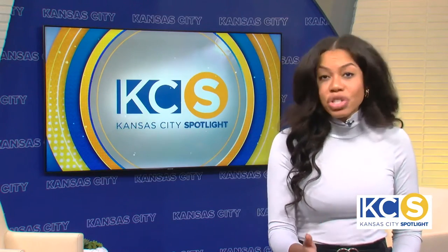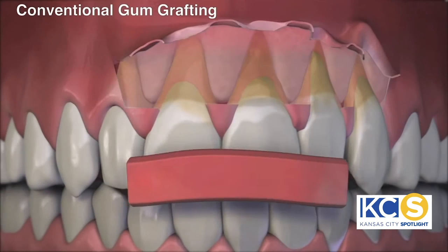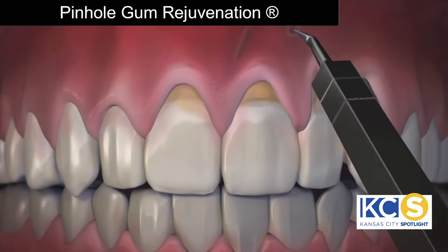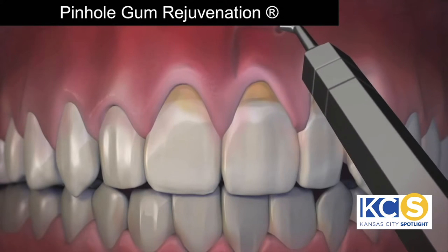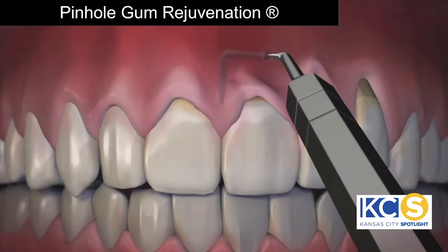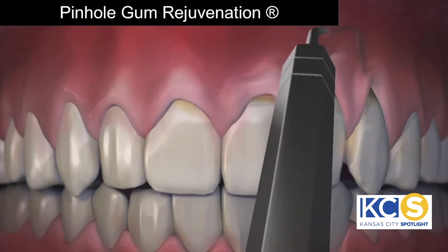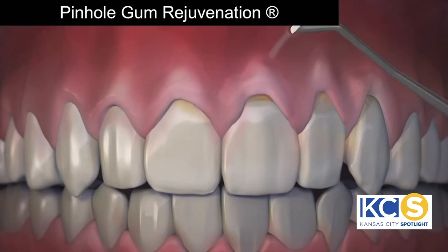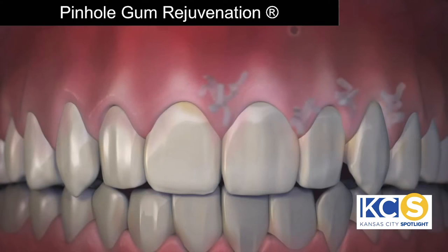How is Pinhole Gum Rejuvenation done, and how does it compare to conventional gum grafting? Pinhole is done with no scalpels, no sutures — that means no stitching — and requires minimum downtime. The entire procedure is done through tiny pinholes in the gums. First, the gum tissue is numbed with a local anesthetic. Then, using special dental instruments that I designed, a trained dentist frees the gum tissue and guides the gums down to cover the exposed roots. The pinholes heal quickly, and most patients report little or no pain and require virtually no downtime at all.